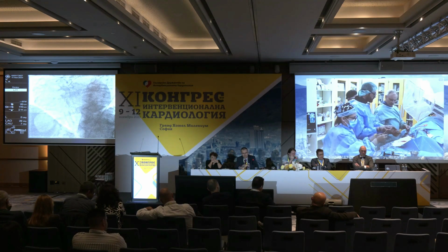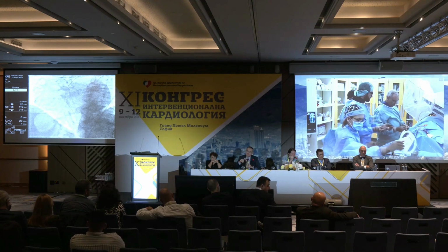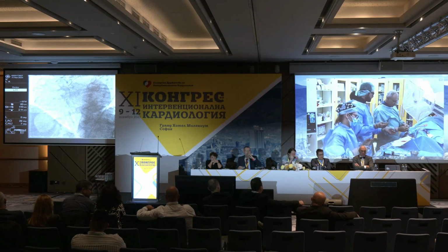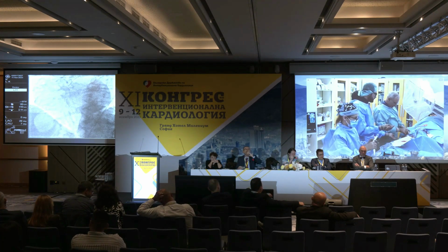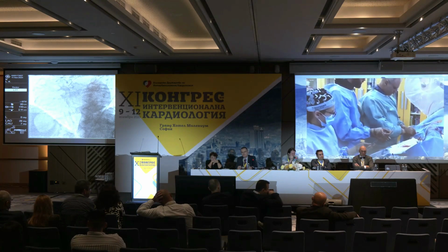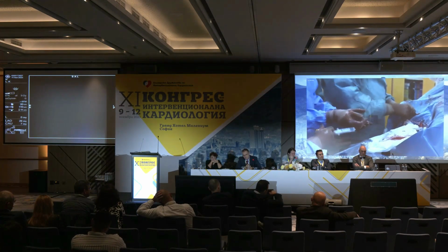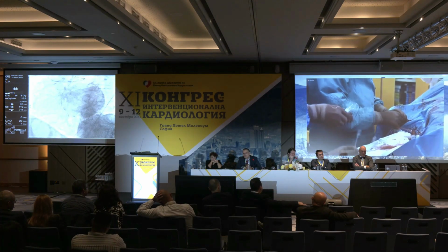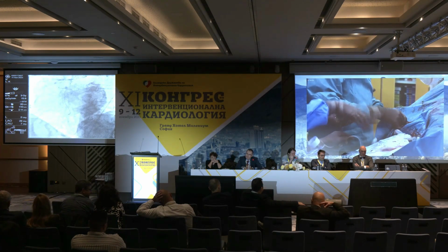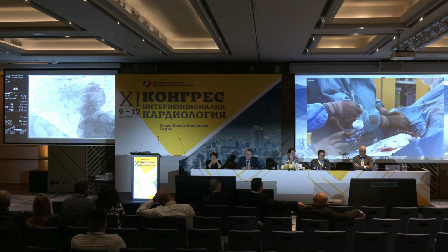We should not stent exactly the ostium, and we should not protrude because the vessel is too big. Yeah, let's take a 5.0 non-compliant balloon, Dr. Gelev, to post-dilate this stent. 5.0 is very good because the vessel there is 5.3. But on IVUS, if we reduce it by 0.5, let's do 4.5? Yeah. Okay.